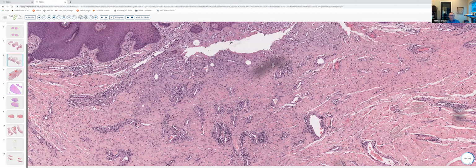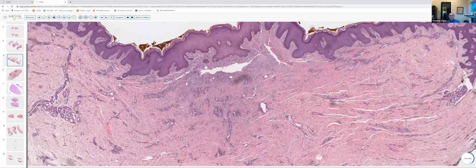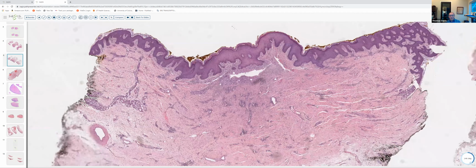And it's kind of important to be able to recognize a scar. I don't think we talk about it a whole lot when we're covering dermpath, but when, for instance, as a dermatopathologist, we're looking at re-excisional specimens, you always got to make sure that there's a surgical scar there. It's kind of a double check to make sure that the correct site was actually treated and excised. Now, a lot of times in a scar, the epidermis will be thinned with effacement of the rete ridge pattern. We just don't happen to see that here, but absent adnexal structures are key.